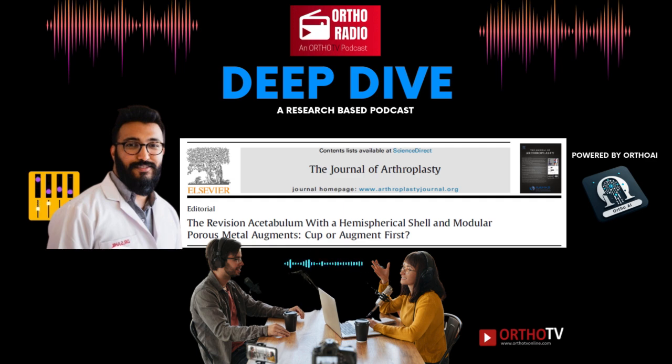Well, the most important thing to remember is that every case is different. There's no one-size-fits-all approach. You need to find a surgeon who listens to you and understands your needs, and who knows about all these options. Exactly. Those augments are really powerful tools. They can rebuild stability, reduce the need for big cups, and provide extra support. Three key functions: primary stability, intracavitary reduction, and supplemental fixation. Got it. And of course, don't forget about cement. Cement, the glue that holds it all together.